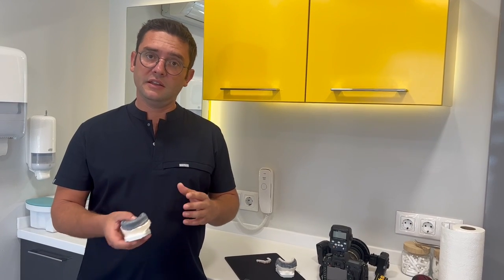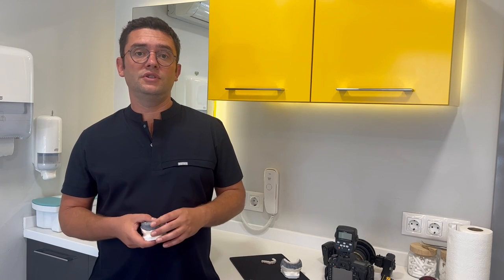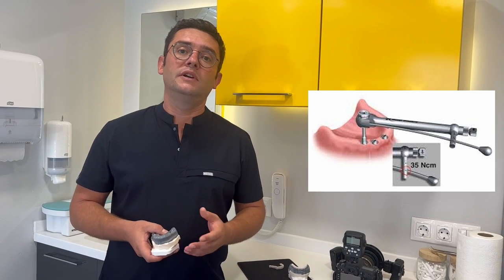In some cases we can place fixed dentures — screw-retained dentures. But to make this decision, first we had to perform the surgery. At the surgery, we calculate the torque level of the implants.